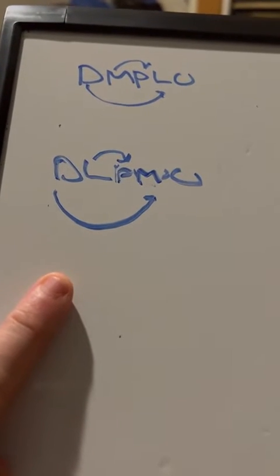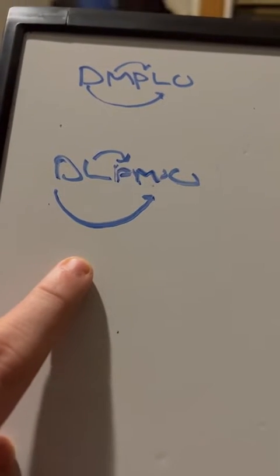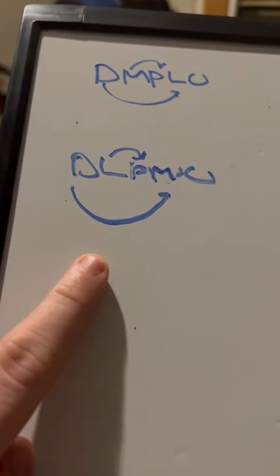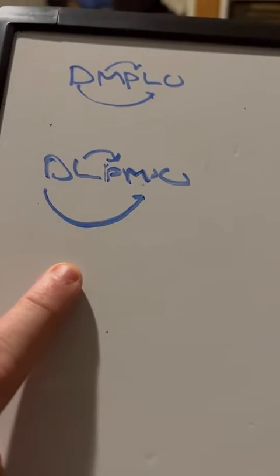By knowing what structures are highlighted by these views, you can work out which view you need to use to see certain structures on your radiographs. So for example, let's start with highlighting metacarpal 2. The first step is to know where metacarpal 2 is.